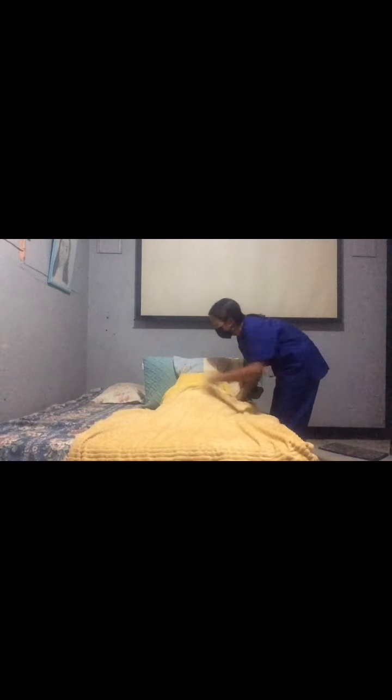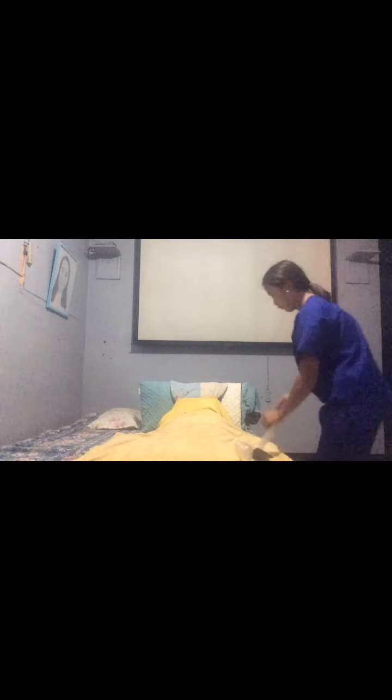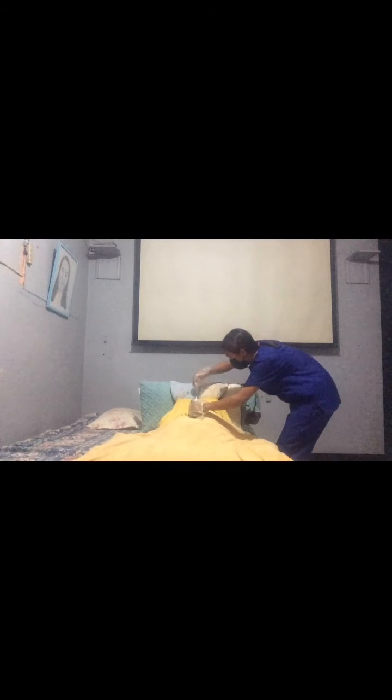Provide privacy and assist the client to a sitting position if not contraindicated. Put on gloves, surgical mask, and protective eyewear. Have the patient face a strong light to ensure the area to be swabbed is visible. Have the patient tilt their head backwards, open their mouth, and stick out their tongue.